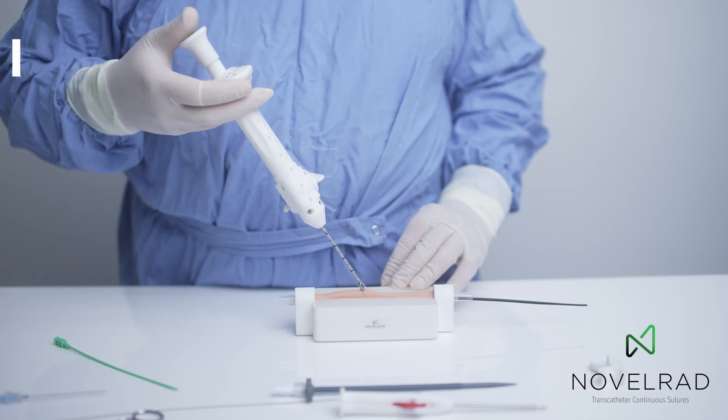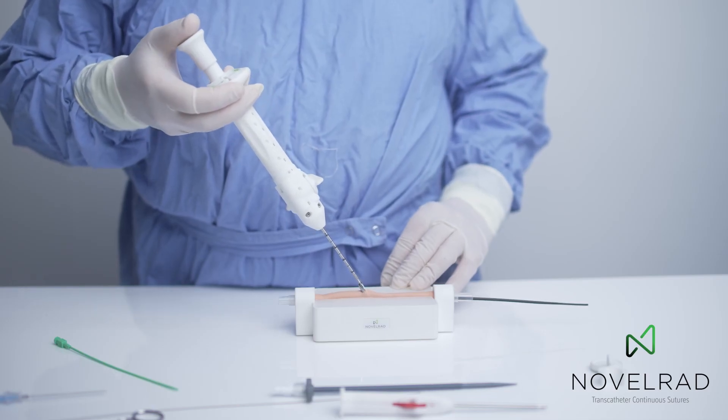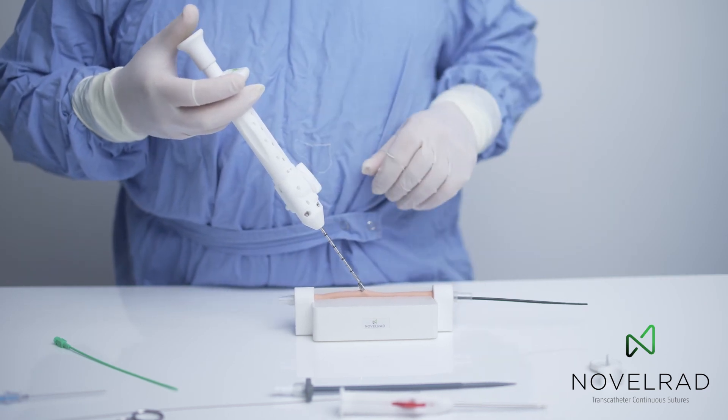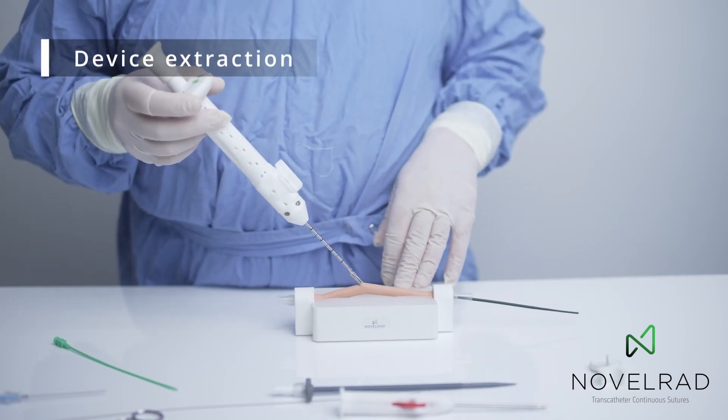Again, a click just to place the suture. And once that's done, we take the pocket out and remove the system.